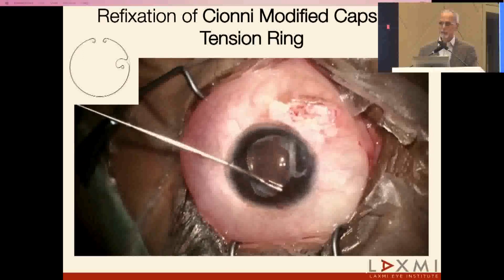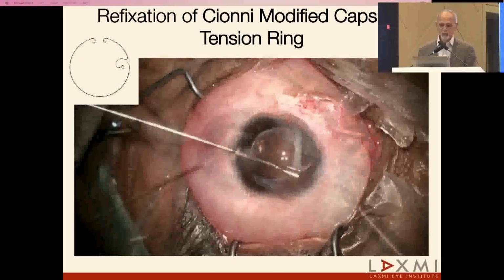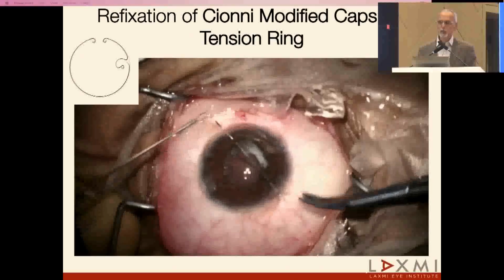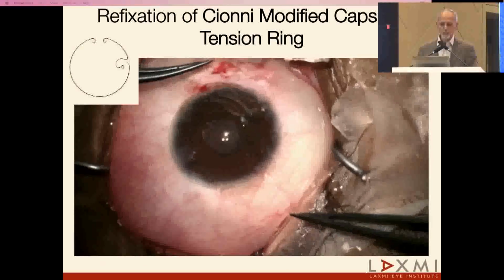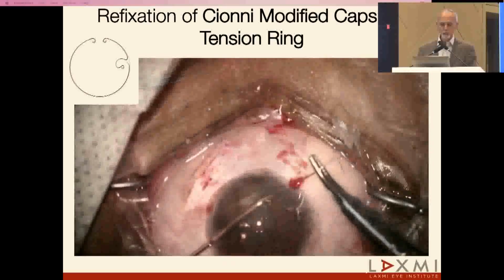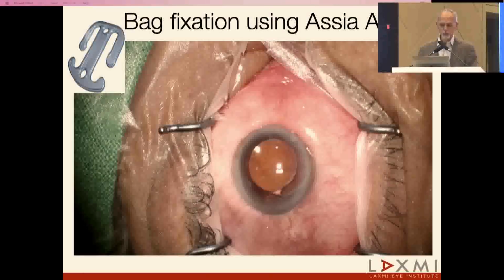which is threaded through that central eyelet, and once it is fixed, since the original pupil had traumatic mydriasis, you try and create a pupil, so you have a bag lens complex that is salvaged, and the pupil is constricted, and the visual rehabilitation is improved.